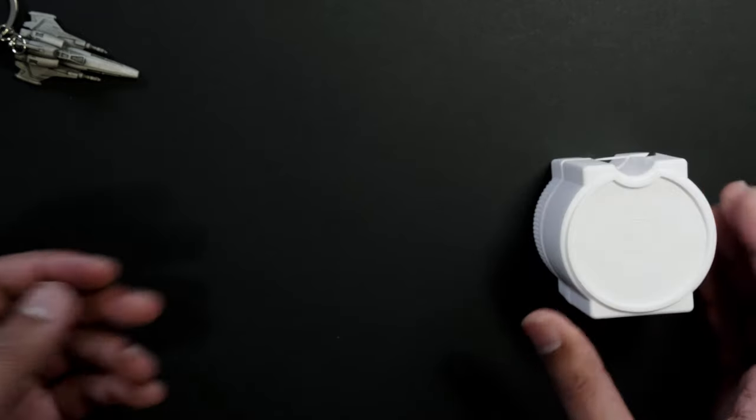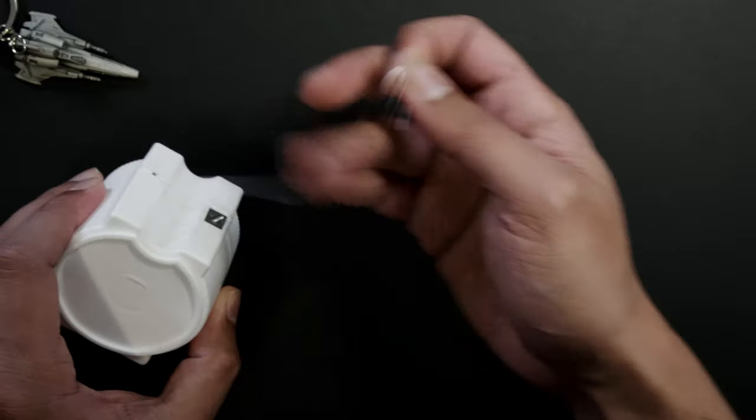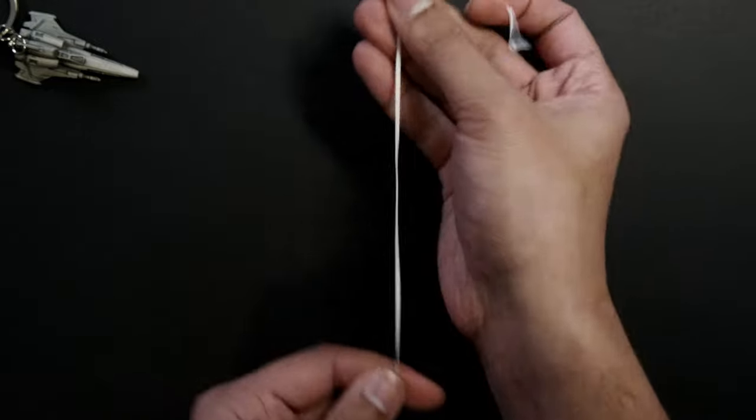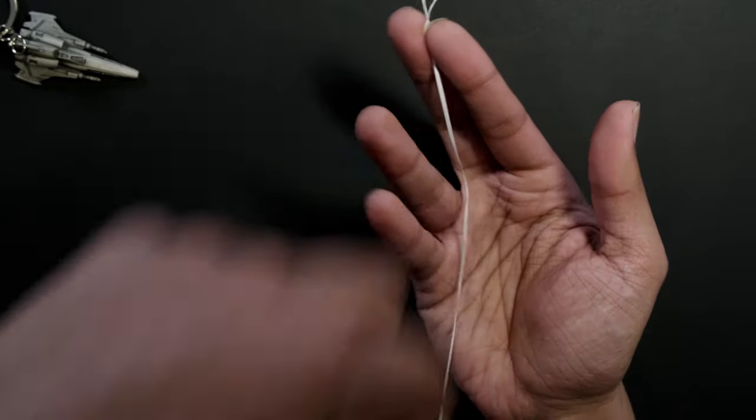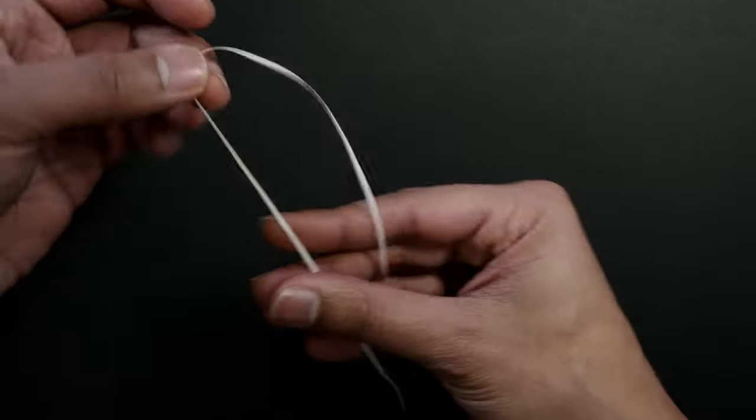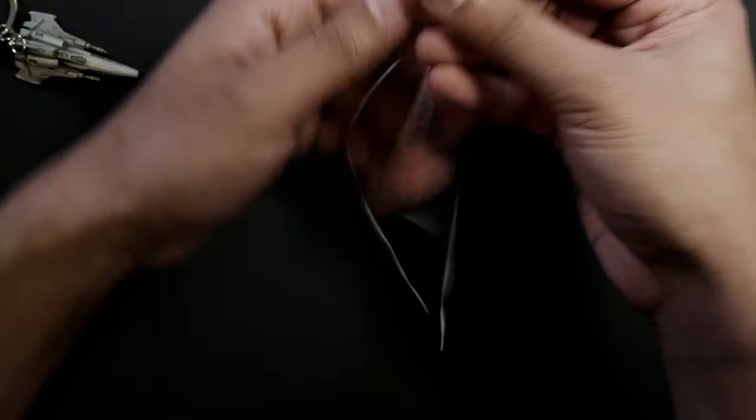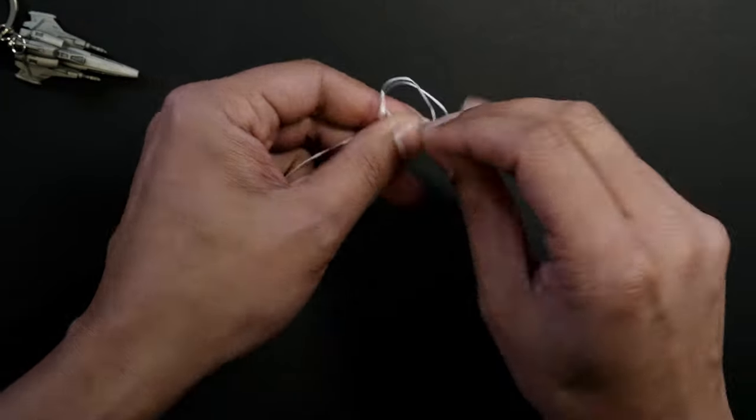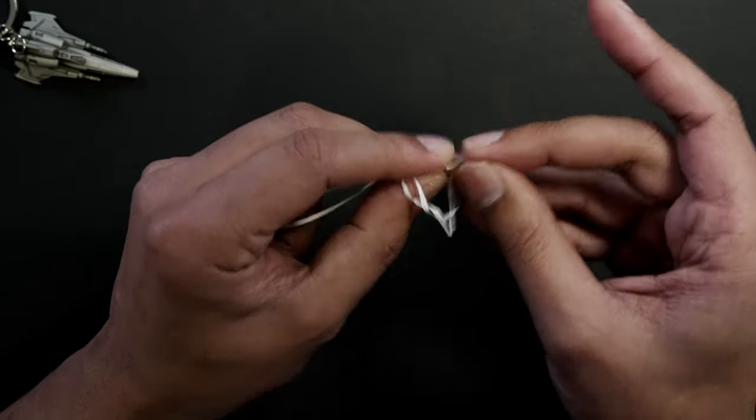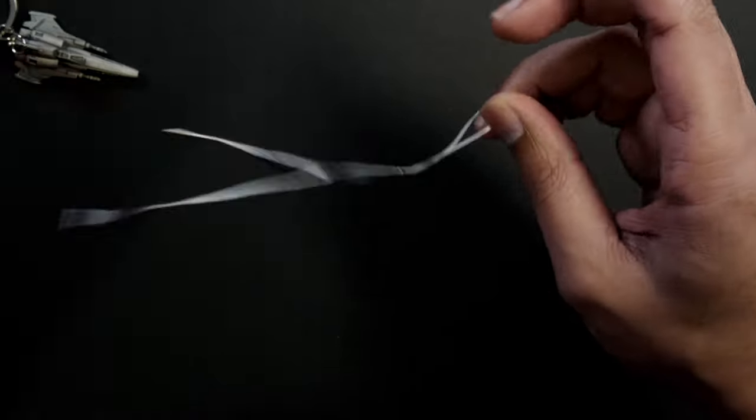So you're going to need some floss. So we're going to grab some floss, about 15 centimeters or so, kind of two palms width. The first ligature is going to be pretty simple. You're going to put it down and you're going to tie a knot in it.